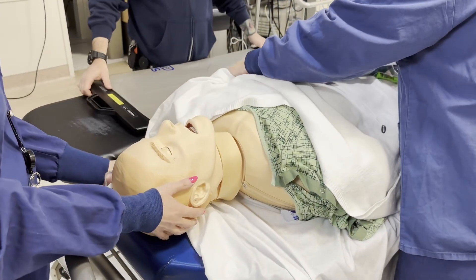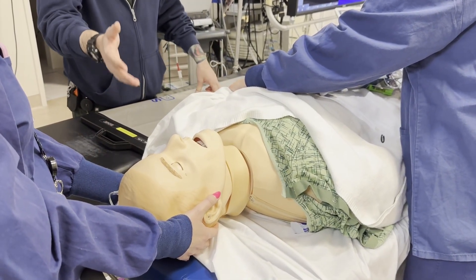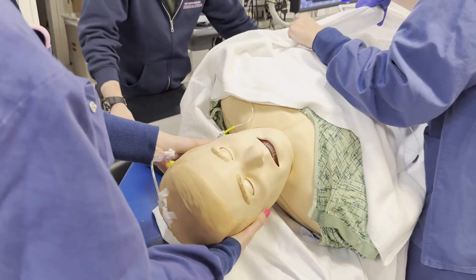We're also going to secure the head by having somebody hold the patient's head and hold the line. On her count — one, two, three — slide the board under.